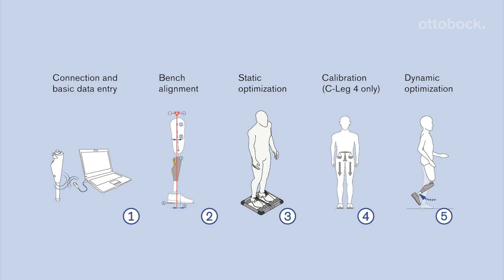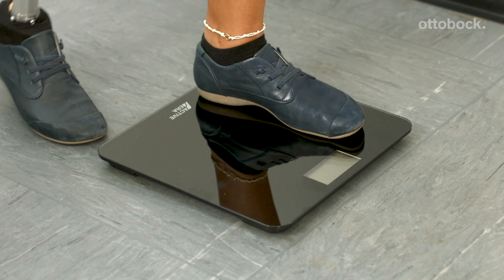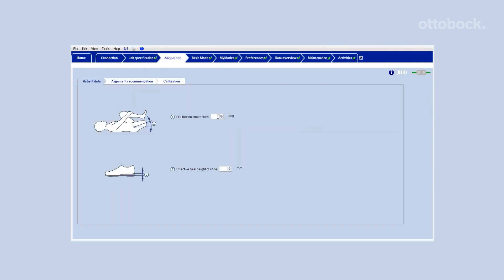Follow the recommended alignment and setup process for the C-Leg 4, Genium and Genium X3 to achieve the best result for your user. To ensure that the C-Leg 4 will release into swing phase, measure the knee centered floor distance without shoe and the body weight with prosthesis. Enter those values and all additional user data into C-Soft Plus.